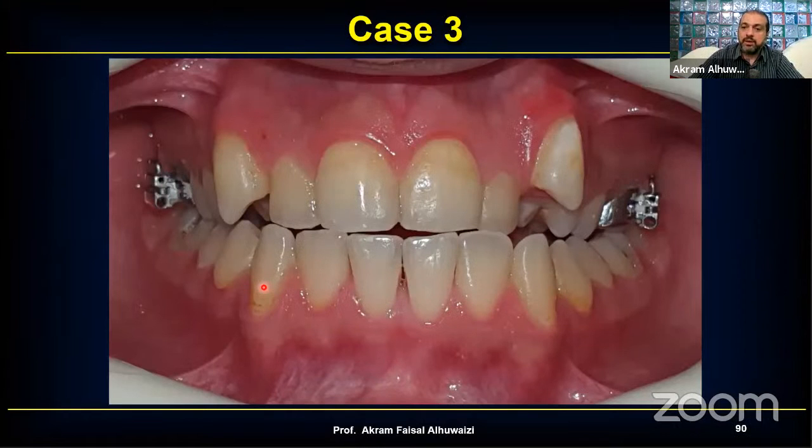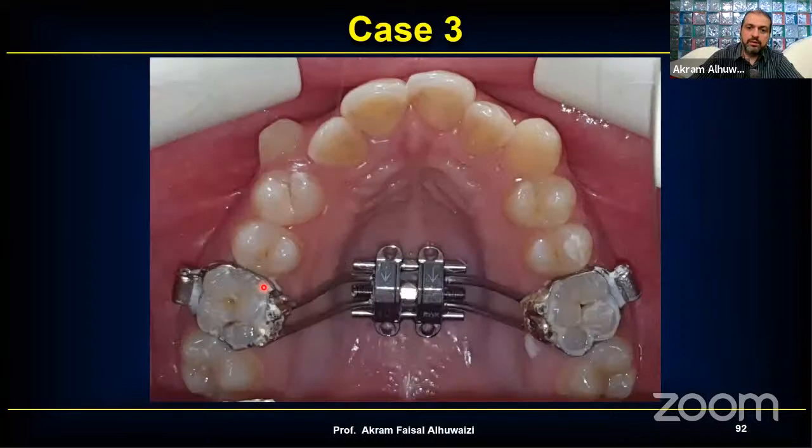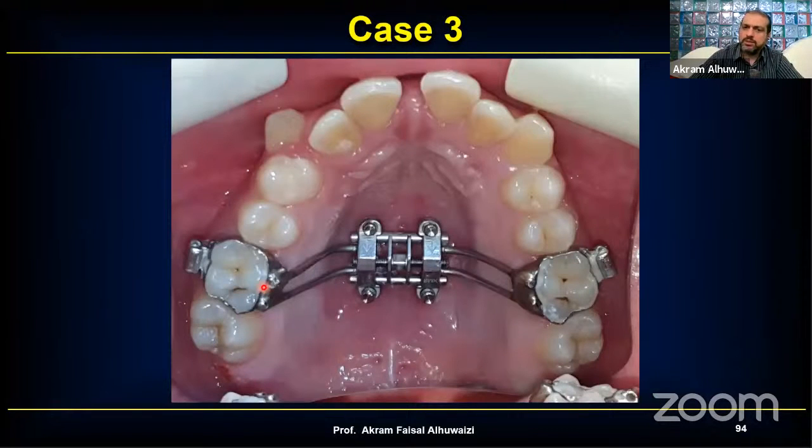So I cemented the appliance inside the patient's mouth, and after putting the appliance inside the patient's mouth, the screws are in, and once after 2 weeks, the patient comes back in again, and you find the suture has opened. And wow, this is my second successful case. And these, the maxillary skeletal expanders, they actually work. They're so nice. Notice that at that time, I was adopting more of an anterior approach. I was still reluctant with going more posteriorly because of my failed case 1.